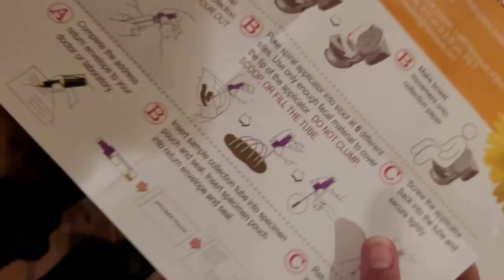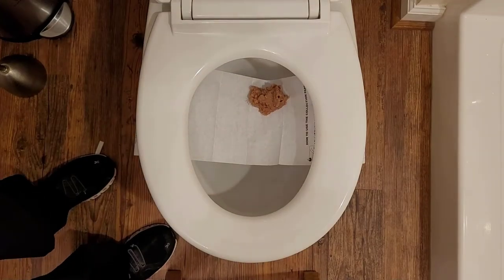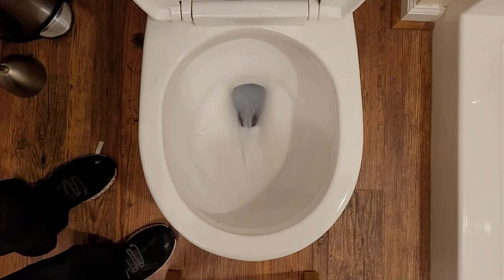And now you're done. If you get confused, there are written instructions in every kit in English and Spanish. Then you can just flush it down — the paper is flushable.